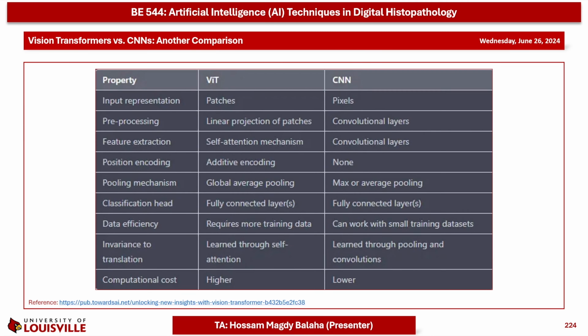We also discussed it using mathematical notation to understand the process behind the scenes. Finally, we made a comparison between vision transformers and CNNs.